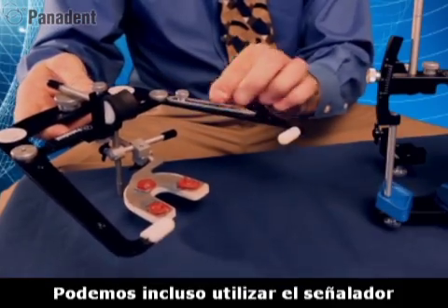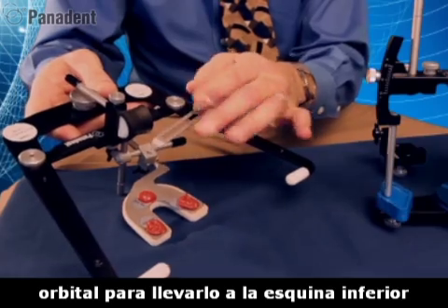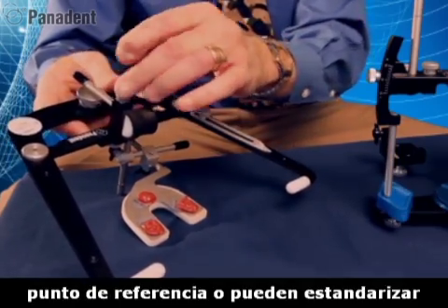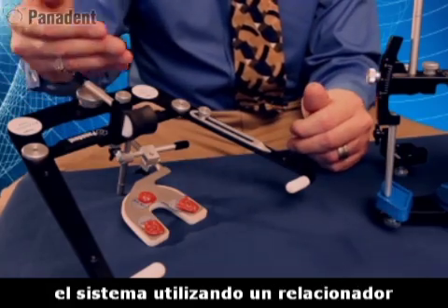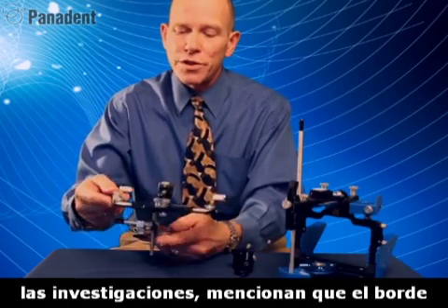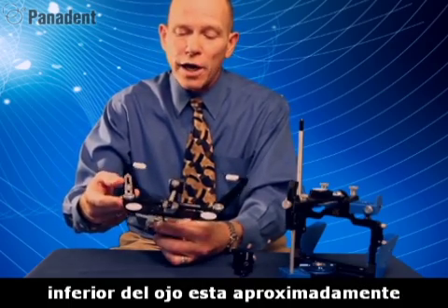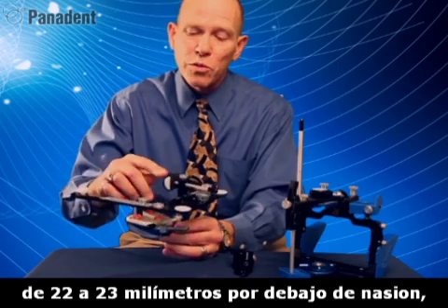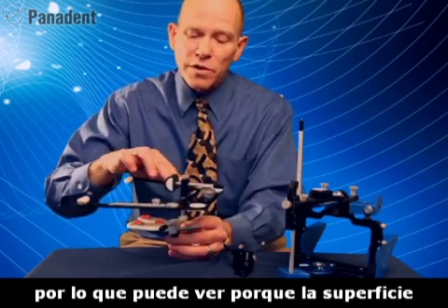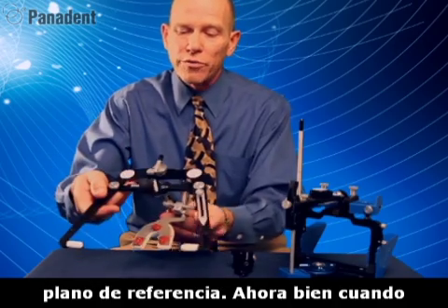You can either use an orbital pointer by palpating the lower border of the eye and putting the spot on the side of the nose to choose your third pointer reference, or you can standardize the system with a nasion relator. According to research, the lower border of the eye is approximately 22-23mm below nasion. So you can see why the upper surface of the face bow represents the plane of reference.